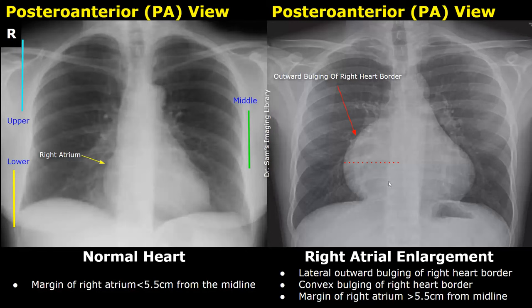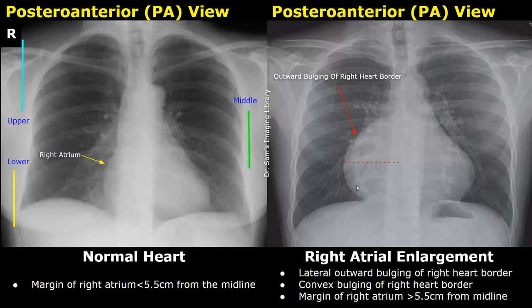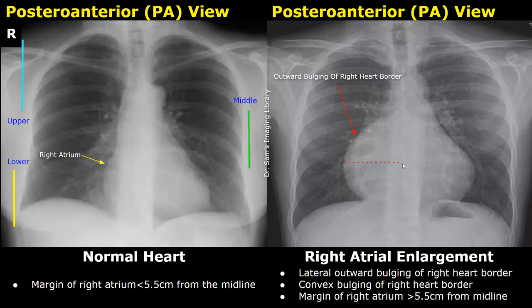Our first case is right atrial enlargement. The right atrium forms the right heart border in a posterior-anterior view. In normal cases, the margin of the right atrium should be less than 5.5 centimeters from the midline, but in cases of right atrial enlargement there is lateral outward bulging of the right heart border, which is convex in shape.